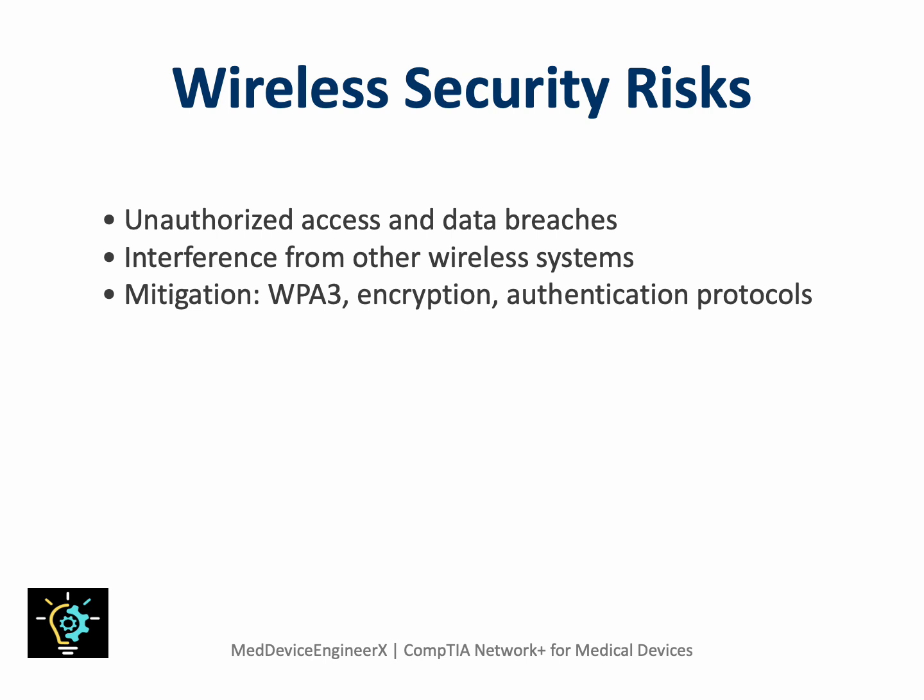Regular software updates and penetration testing are part of standard maintenance. For example, a wireless infusion pump must only communicate with verified systems. Security isn't just about blocking hackers, it's about maintaining system integrity and patient trust. In short, secure wireless networking is as critical as the medical devices themselves.